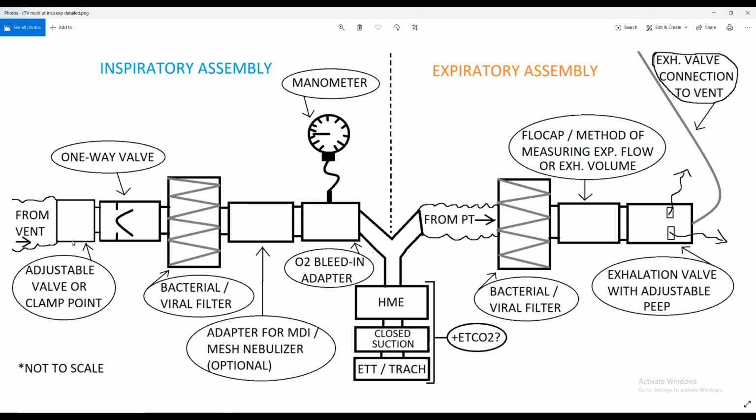whatever we want the patient to get, still take advantage of the wonderful one-way valve filter, aerosol if we have to, and here we go, this wonderful little O2 bleed-in adapter that's connected to a manometer. We could adjust our valve or adjust our clamp point here to the desired pressure that we actually want the patient to get. And then when they exhale, so we already took care of humidification, we got closed suction, maybe some end-tidal in there. They exhale through another bacterial viral filter.